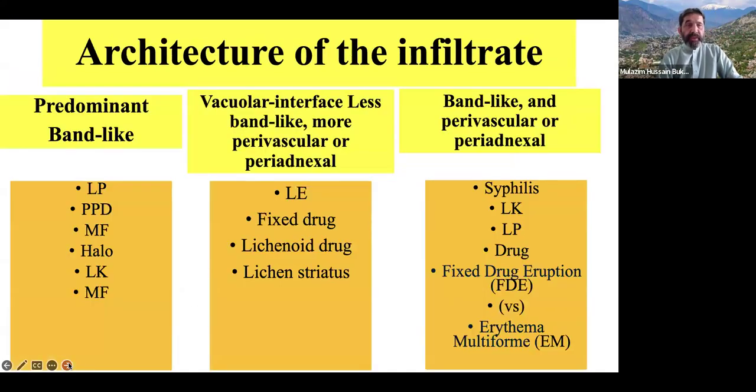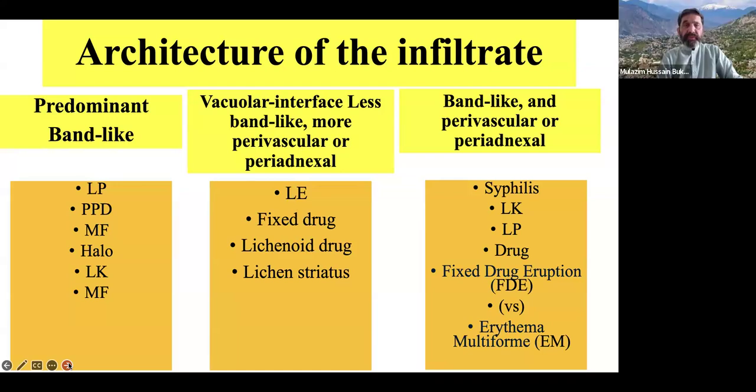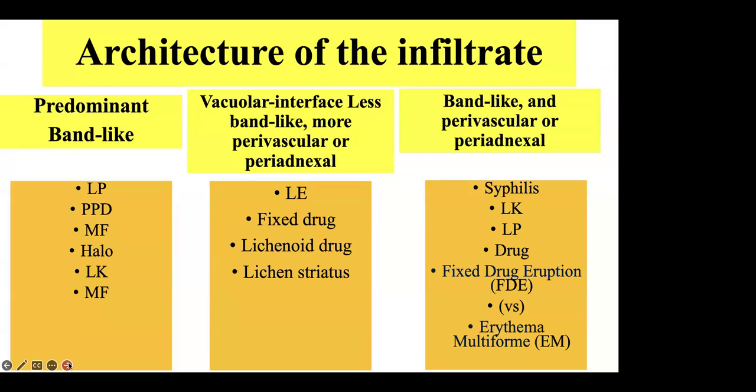Okay, a prominent band sometimes in lichen planus, PPD, MF, and lichenoid keratosis, and sometimes you see the vacuolar interfaces. They may be.